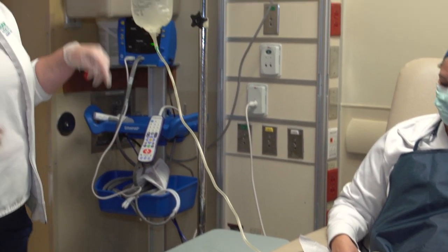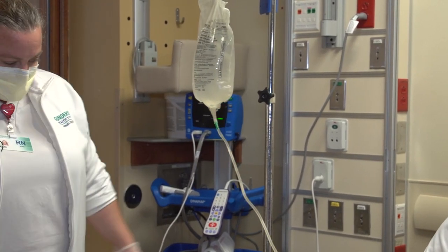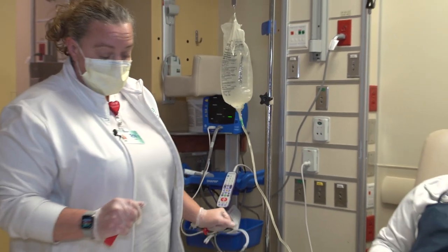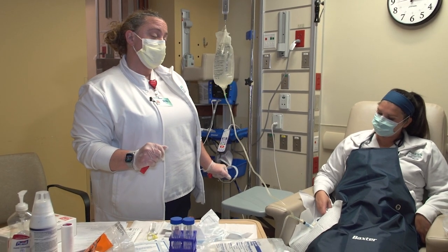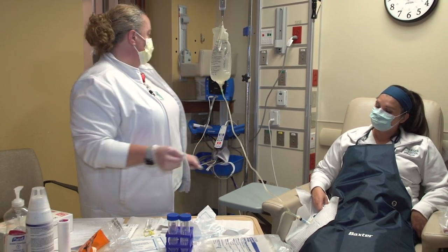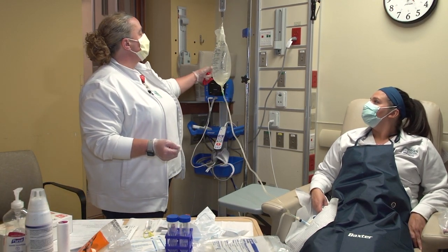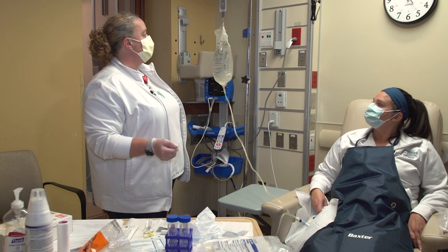Using my spring scale, I'm going to drain my ultra bag to what my fill volume will be. If a patient will tolerate it, I recommend 2 liters or their fill volume. So you can drain this to the 2 liters.